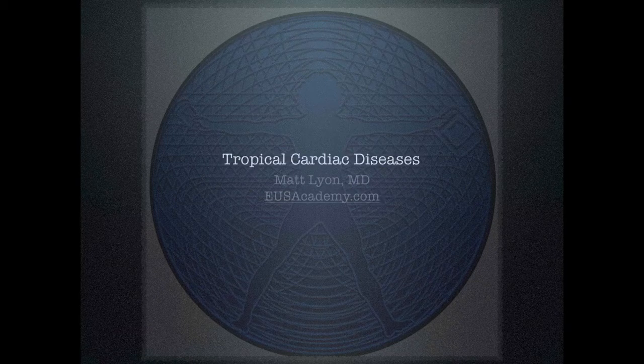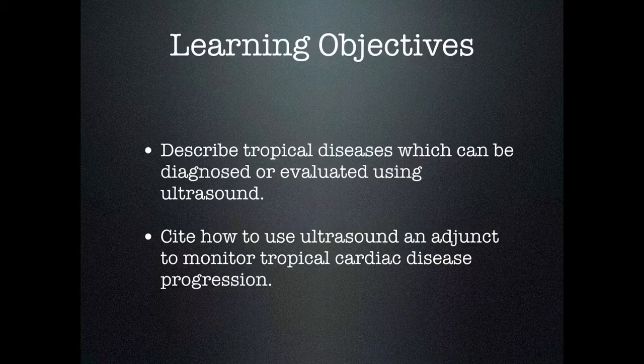This is Tropical Cardiac Diseases, and I'm Matt Lyon. Our learning objectives are to use ultrasound to diagnose and evaluate various cardiac tropical diseases, and also to cite how to use ultrasound as an adjunct to monitor tropical cardiac diseases in their progression, as well as monitoring after treatment.